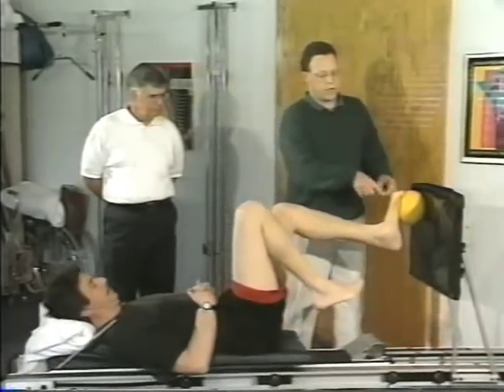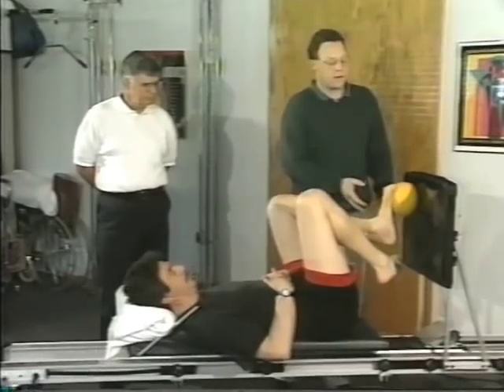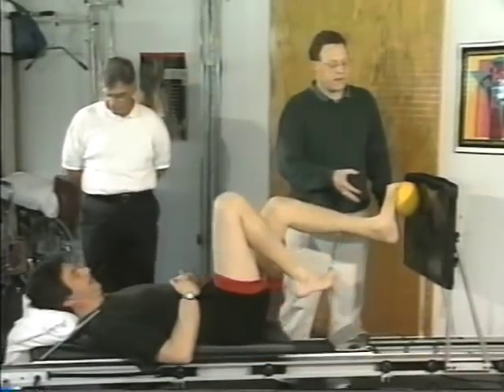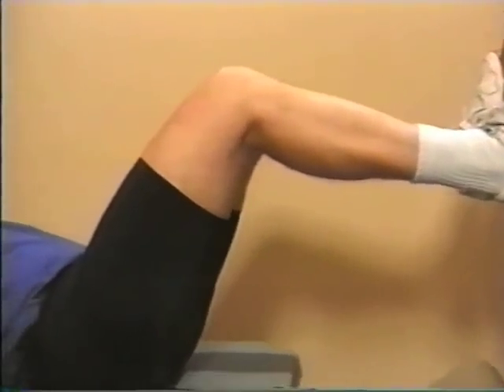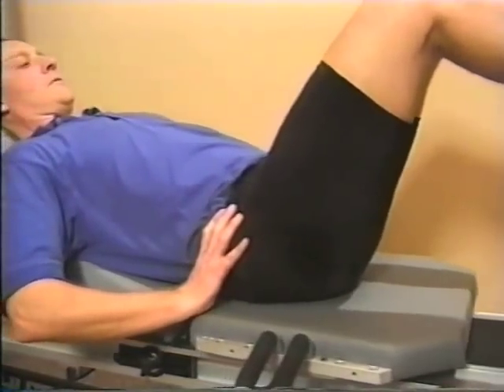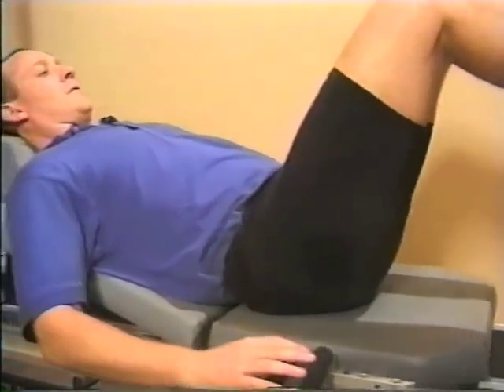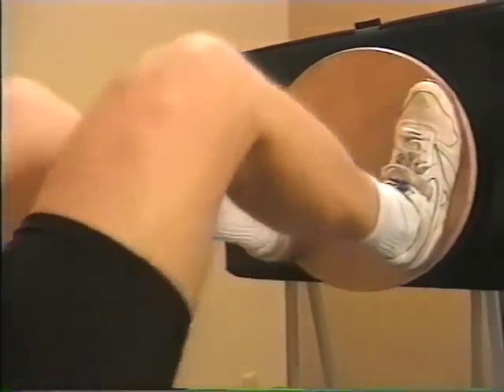Other proprioceptive activities that focus more on balance are easily achieved on the shuttle. With two feet on the wobble board, this simple closed chain exercise becomes an activity for stabilization, affecting the entire kinetic chain right up to the pelvic floor — a particularly safe and effective exercise for lower back patients.